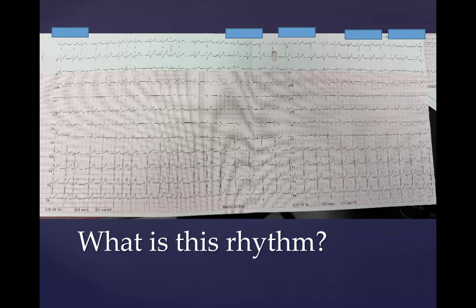I think with ablation, in a small size of a patient, 20 kilos, and then the ablation catheters, and you can correct me if I'm wrong, but the sheath size might be a little too large for a patient of that size. Well, what size is the sheath for balloon atrial septostomy in a newborn?